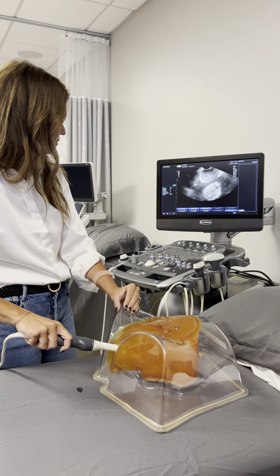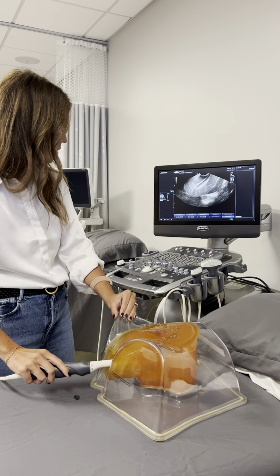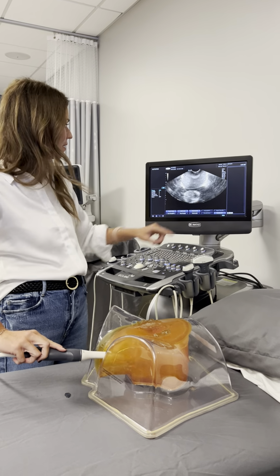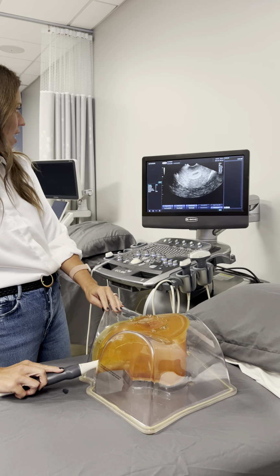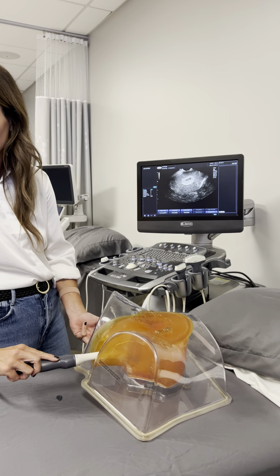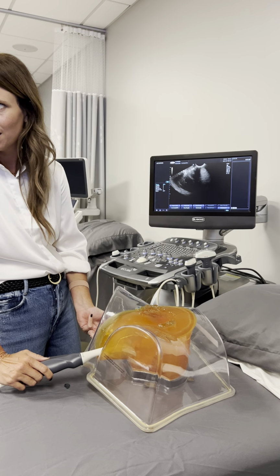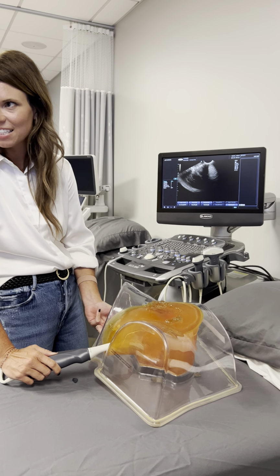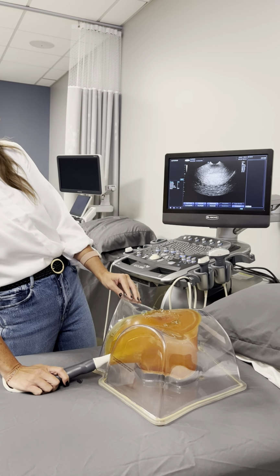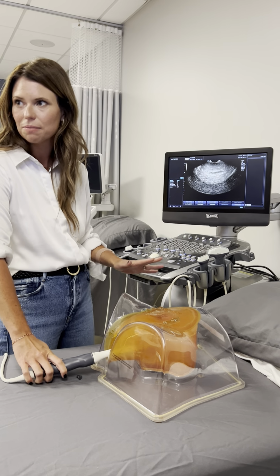Where'd you go? Let me find her again. There she is. Okay. So you're looking at the cervix. This is supposed to be the rectum right there. And then you're going to take your images up. This is why they're on pads, or you have stirrups, because you have to raise the probe up past what the table goes, right, to look at the fundus. So then you'll take your images that way and go all the way to the fundus. Does that make a little bit more sense?